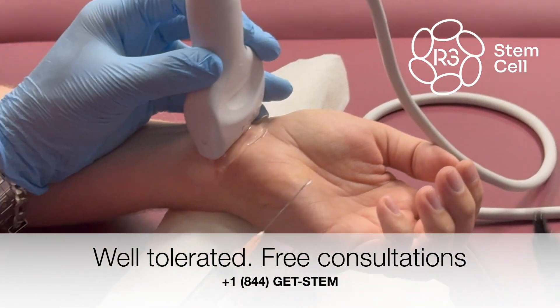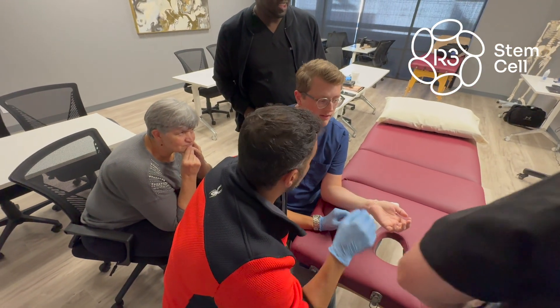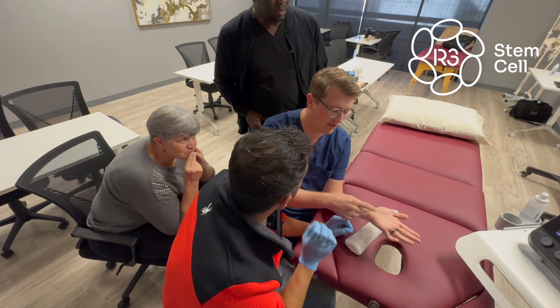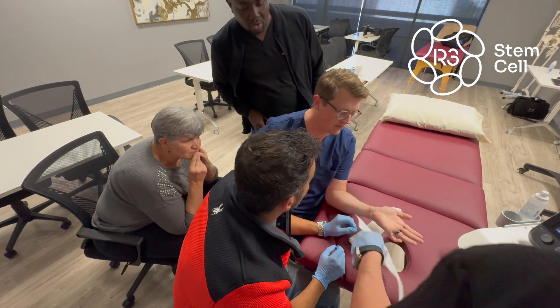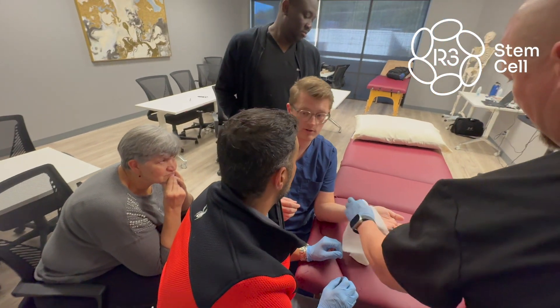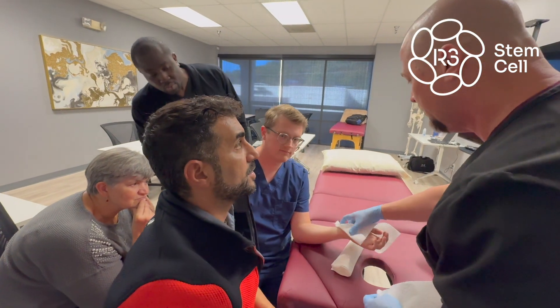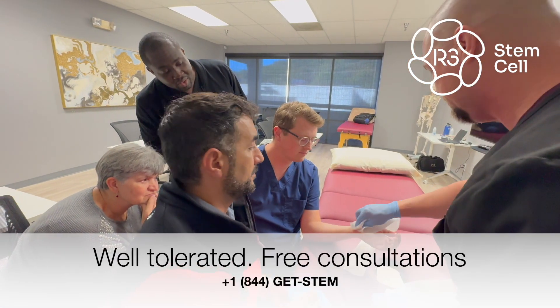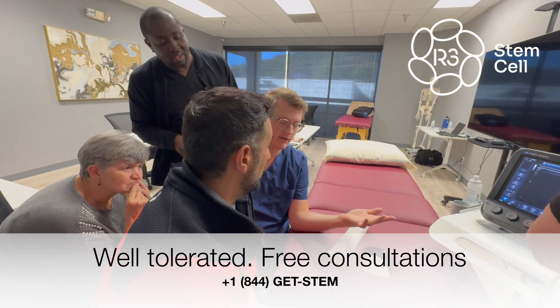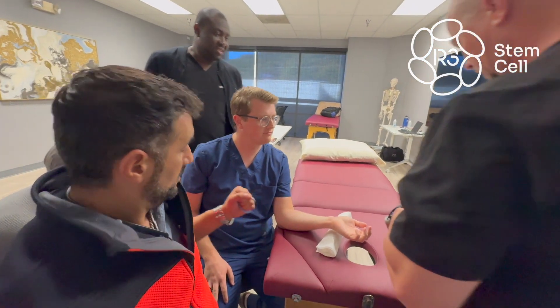There we go — excellent work, pretty cool. It felt like you came real close to it. Well, it wasn't what I was expecting — I was expecting a shooting sensation, but it was more just a lot of burning. You did a great job. Not to be surprised, you won't find a big bubble because you put four cc's superficial, so you will find that little bubble. That was fantastic. Very nice to meet you — excellent work, thank you guys.